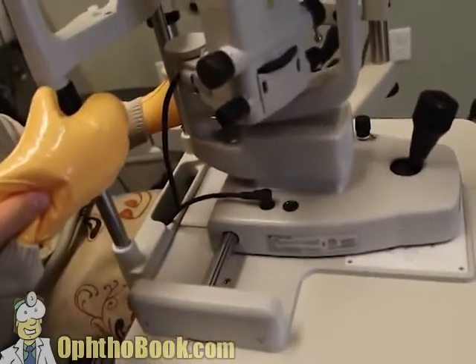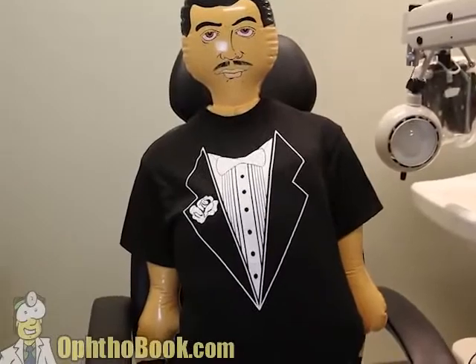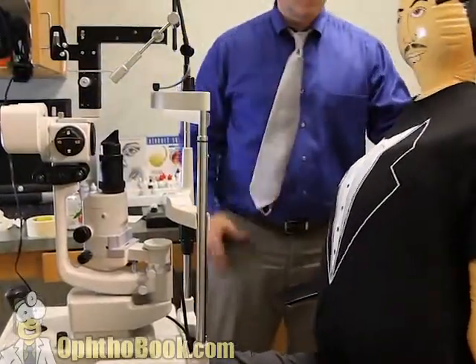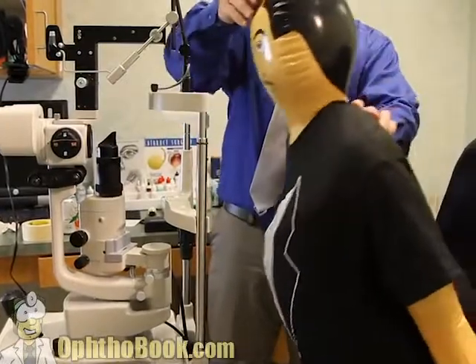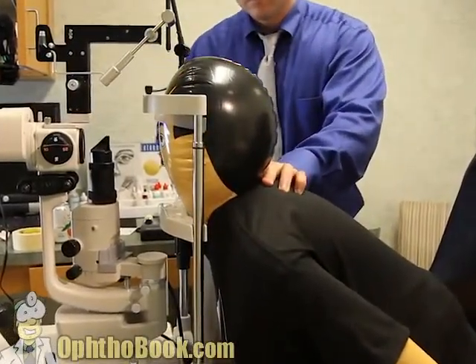The patient can grab onto the side of the table or the side of the microscope here. Occasionally you'll have a chubby patient with a very large abdomen, very hard to get up to the microscope, and I find it helpful to make the microscope very low and far away for them so they can rotate down and into it. And you'll notice here that I'm pushing on the back.